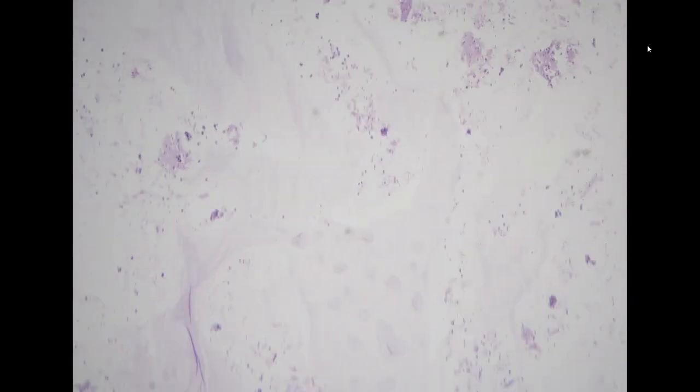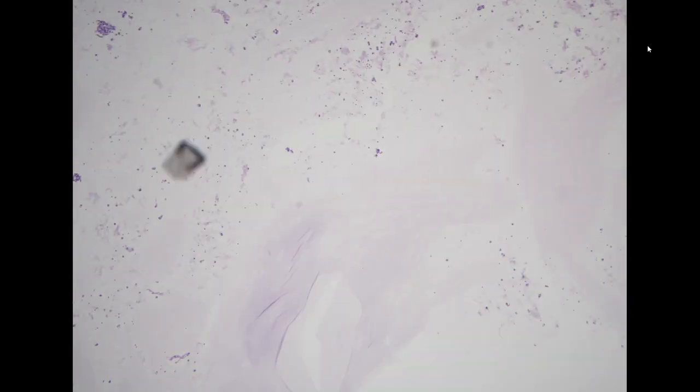So we would do a MOC31 on this one. And please, I think this is Yowei, please retrieve the requisition sheets. I want to check what happened originally. Going back, we signed out the first specimen as negative, so we need to double confirm if anything's wrong.